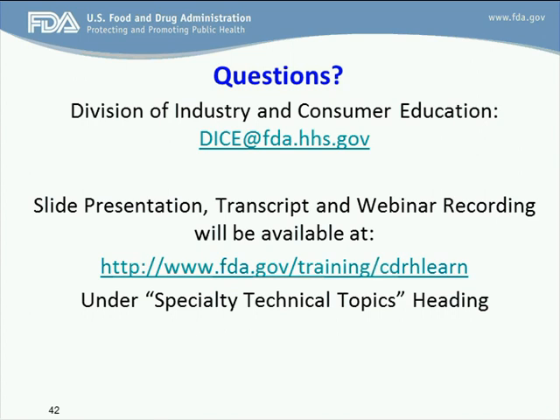And so you can't do a cocktail of microbes? It's preferable to test each organism separately. If you can provide justification for doing a cocktail, you can provide that, but generally we've requested that each organism be tested separately. Okay, thank you.